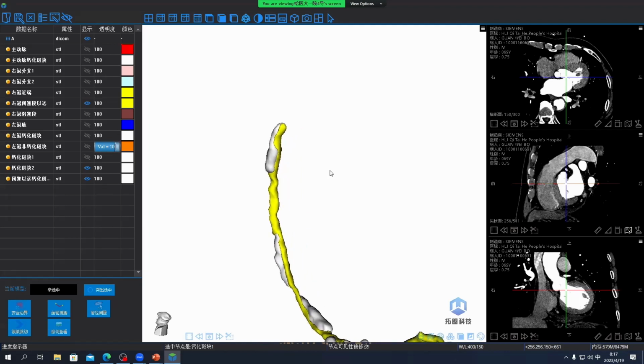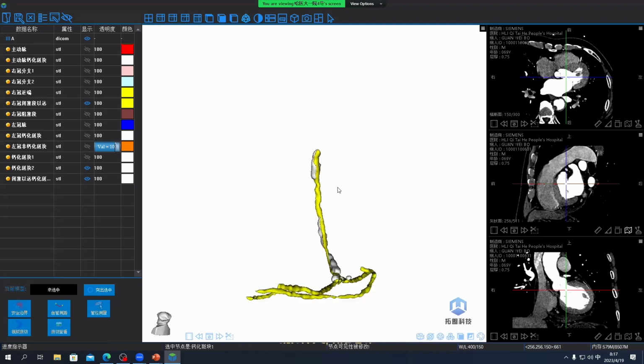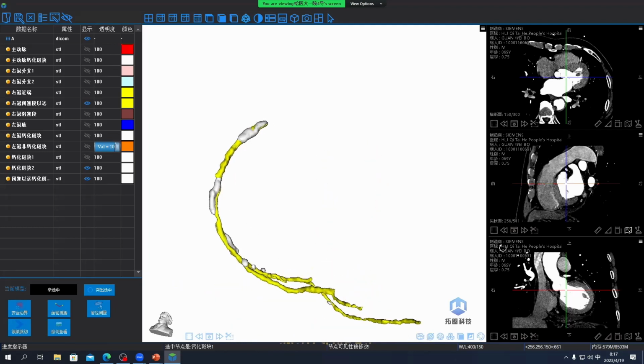And we can also see in the distal portion, zoom out a little bit, rotate at AO view. We can also see in the second part and the third part, the connection area of the RCA, there is also a very big calcified lesion. So if the wire goes outside, it will be very difficult to enter into the distal lumen.